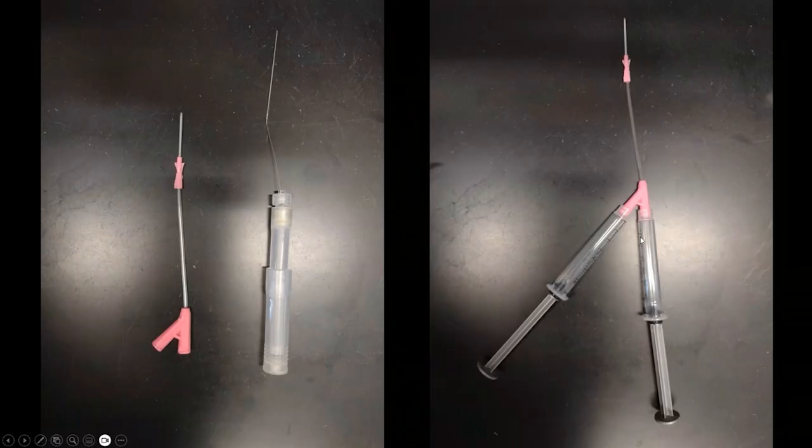It takes a little practice to manipulate this syringe with 2 hands while you're holding the catheter end and putting it inside the trachea. So what will happen?